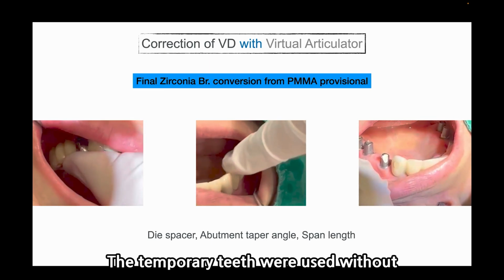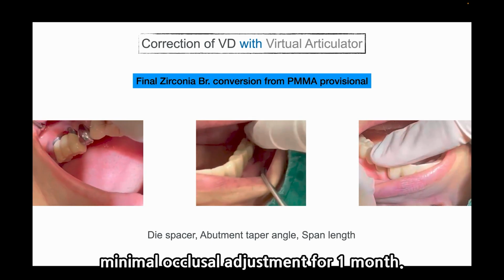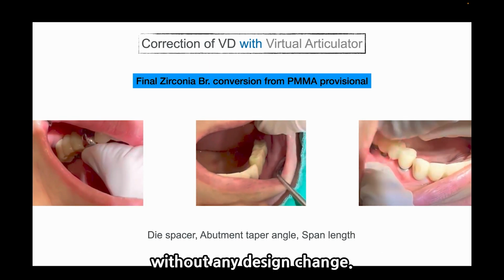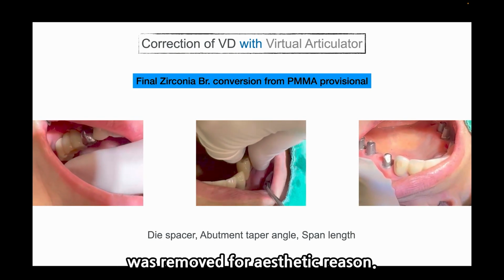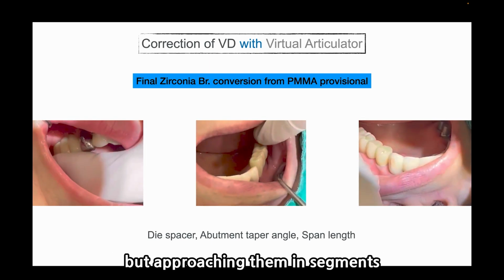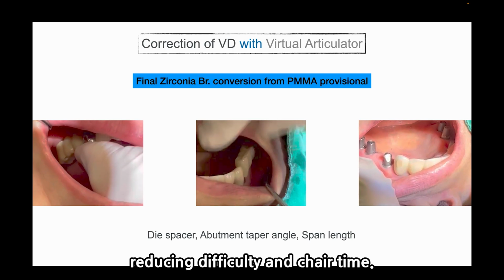The temporaries were used without significant discomfort, with minimal occlusal adjustment for 1 month. I changed the material from PMMA to zirconia without any design change. In the anterior section, the screw hole was removed for aesthetic reasons. Full mouth implant may seem challenging, but approaching it in segments lowers the required accuracy level, reducing difficulty and chair time.